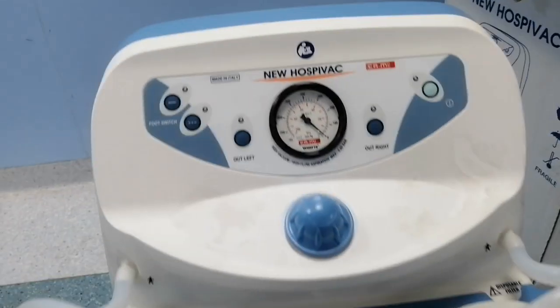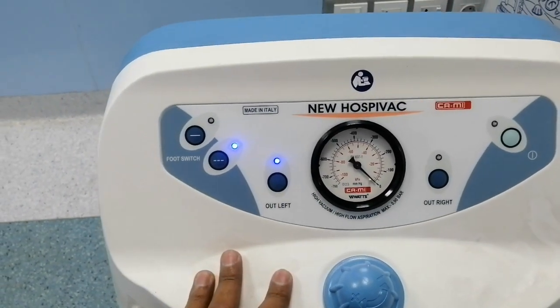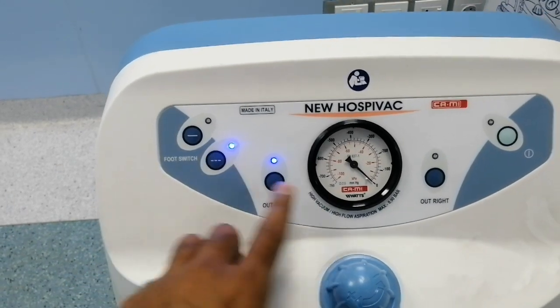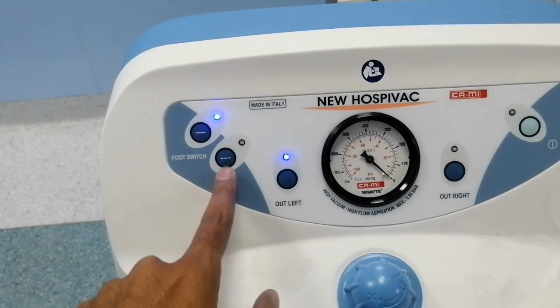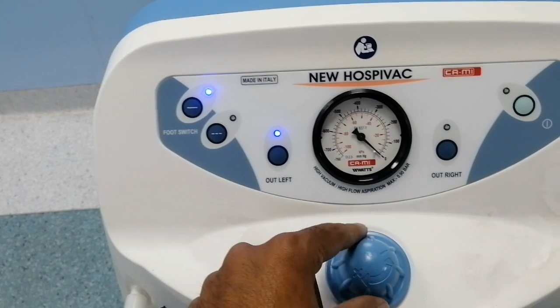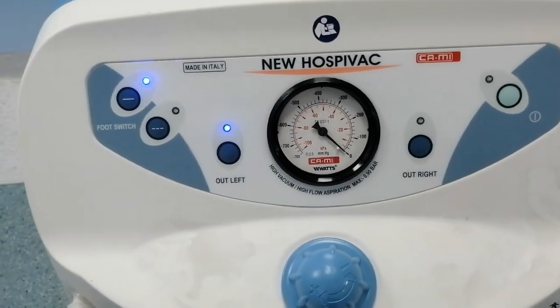When we press the power switch, a self-test is initiated and then the right and left bottles turn on for operation. Here is the single and here is the double foot switch system. Here is the gauge for the maximum and minimum vacuum pressure.